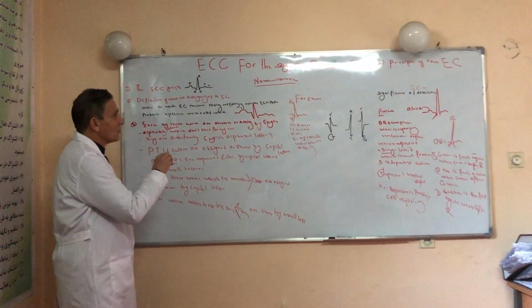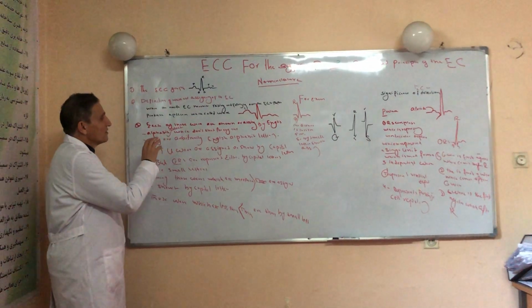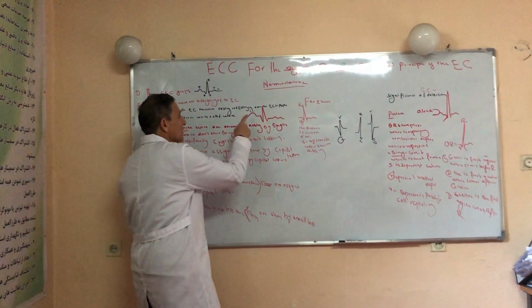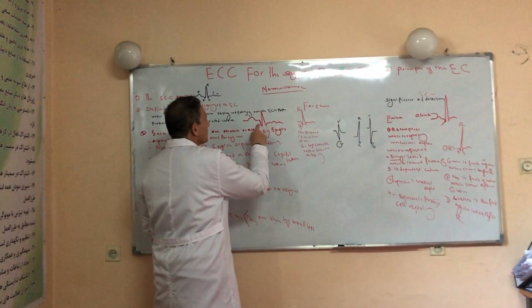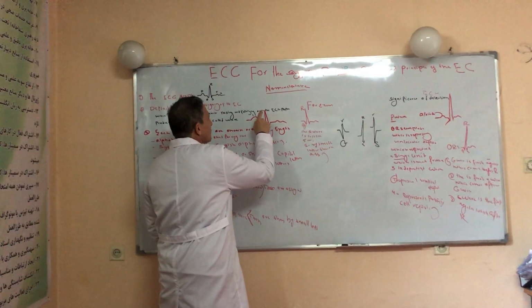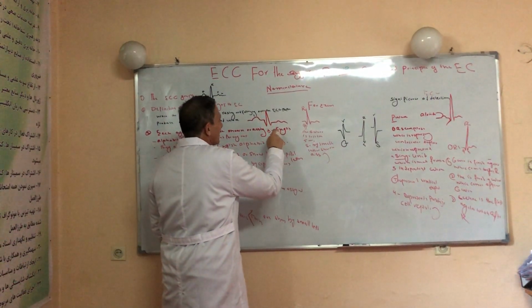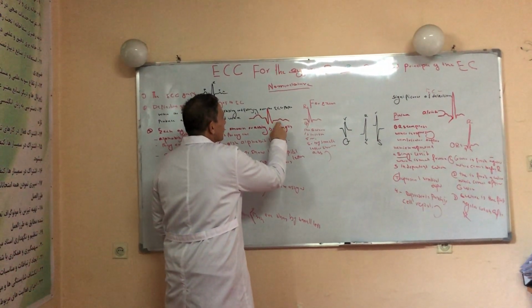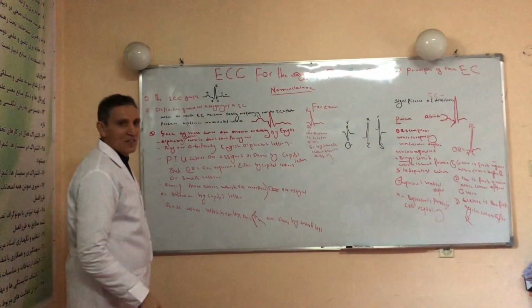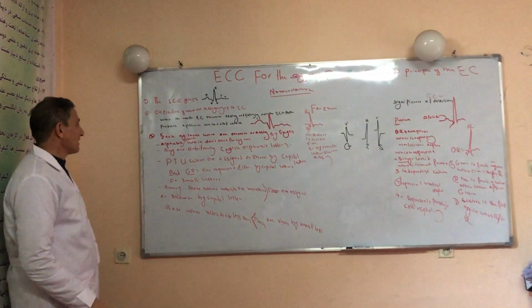Right now we are talking about those ECG patterns which are made from atrial depolarization, septal ventricular depolarization, free wall ventricular depolarization, and ventricular repolarization, and the U wave represents Purkinje fiber repolarization.